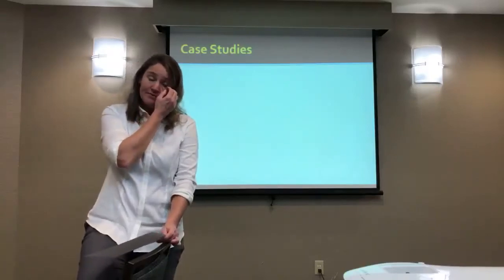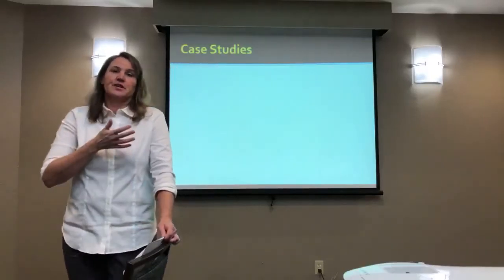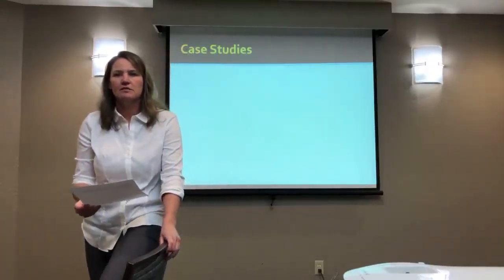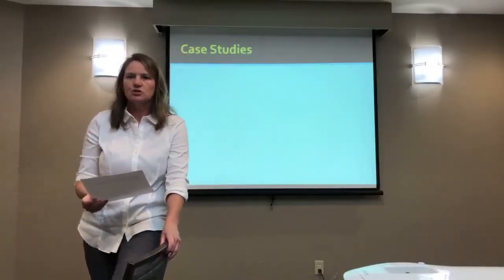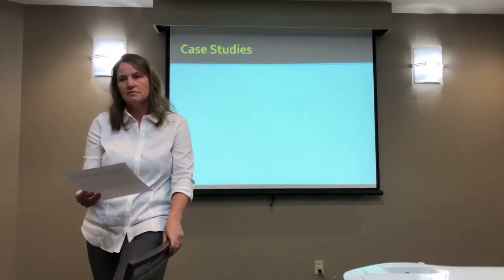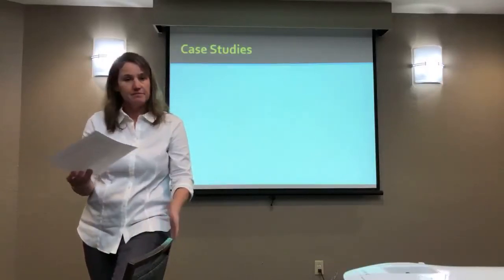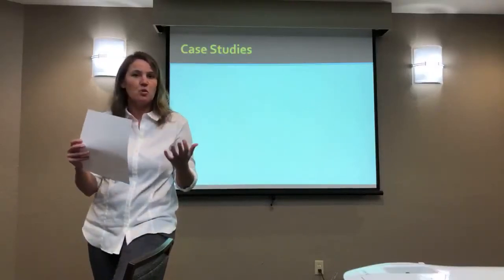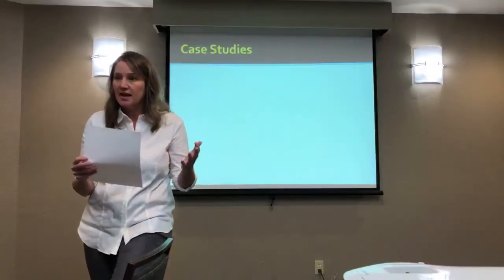What about goals? This is one where, how do you document? In general, if you have somebody who presents with more of an acute musculoskeletal injury, how do you document progress? Decreased pain, increased range of motion. Exactly. Increased function. So decreased pain, have them quantify their pain in some way, a 0 to 10.